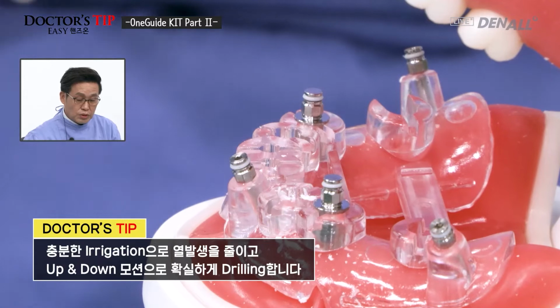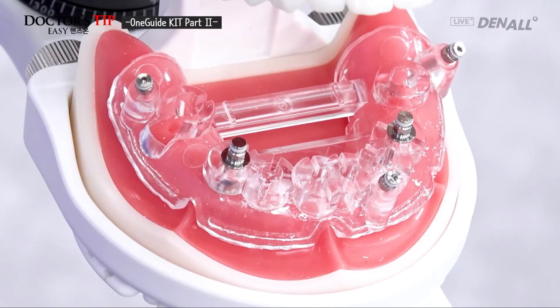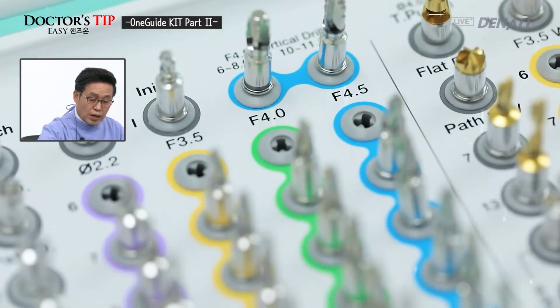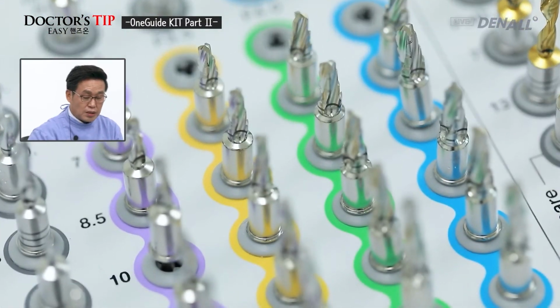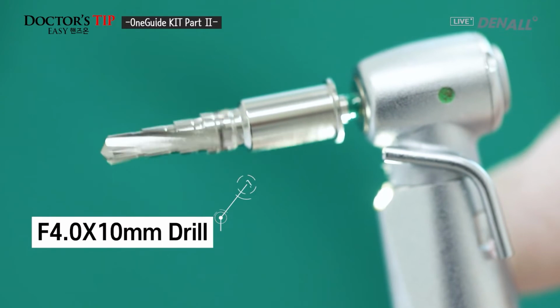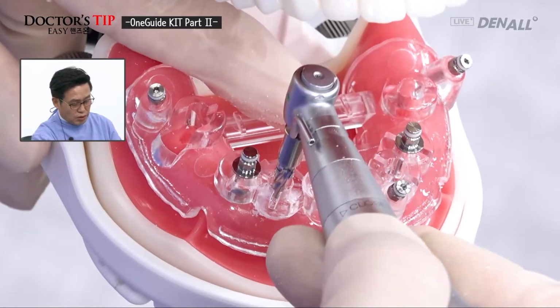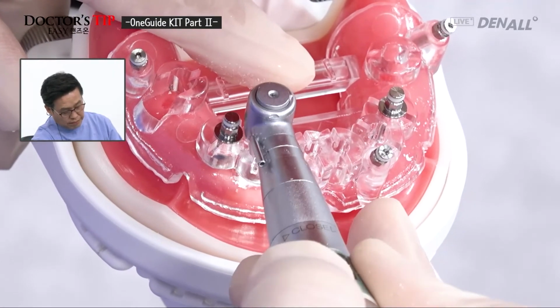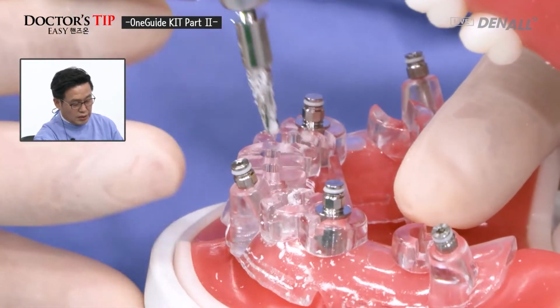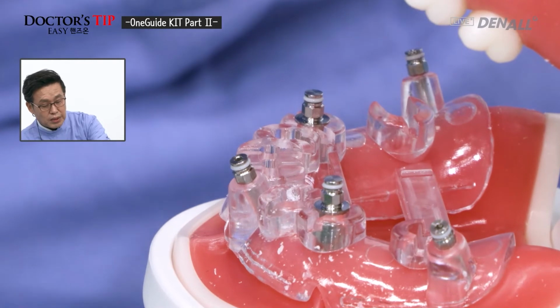I'm going to do up and down motion and do irrigation to minimize heat generation. On both canine sites, 4.0 by 10 millimeter is going to be placed. OneGuide drill 4.0 by 10 millimeter drill is chosen. This drill has been chosen. Again, I'm going to drill full length on both canines. I'm going to drill full length on this side as well. Drilling is complete, and I'm going to place the implant now.